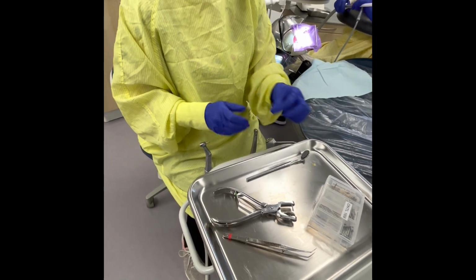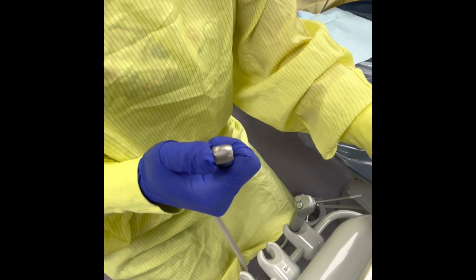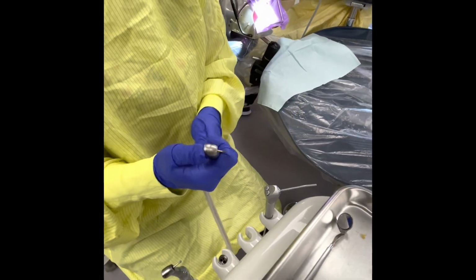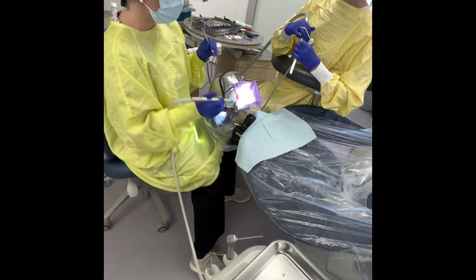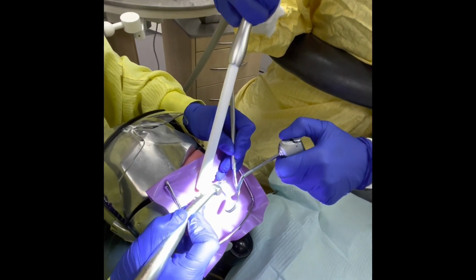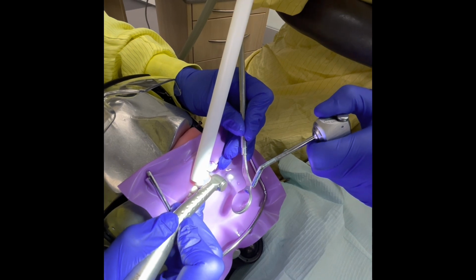They come with a plastic coating on them. I'll take out this 330 burr. I will leave it on the tray. Place my polishing burr. Okay. Take my mirror back. And we're going to smooth the lingual of the restoration. So again, you're going to come in for the suction there. Stacy's going to come in and get ready to blow puffs of air onto the mirror to ensure that I have vision.